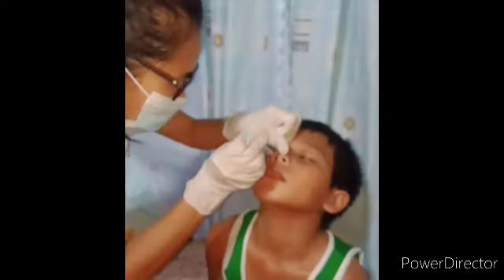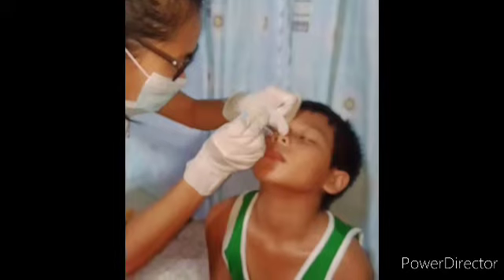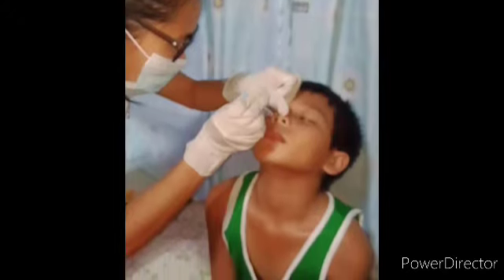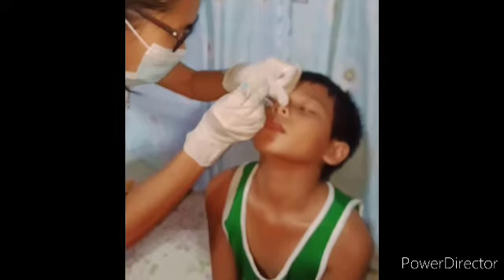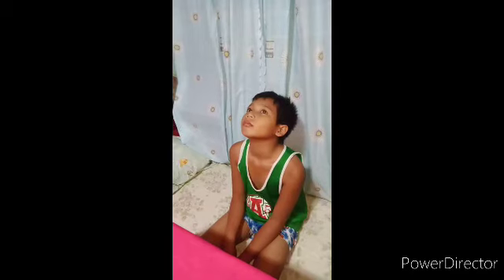Rationale: breathing through the mouth helps prevent aspiration of the solution. The soft tubing will protect the patient's nares from injury during administration of medication. Touching the nares may cause the patient to sneeze and will contaminate the dropper. Have the patient remain in position with head tilted back for a few minutes. Rationale: tilting the head back prevents the escape of the medication.